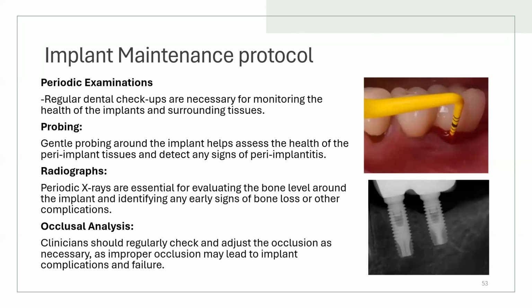Teeth can over-erupt, and the occlusion may be established over the implant, like it is over the adjacent teeth, and we must check them regularly to do occlusal adjustments.